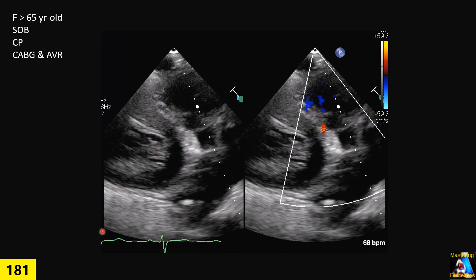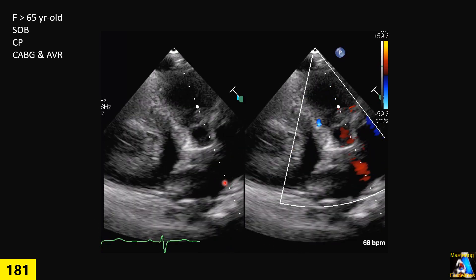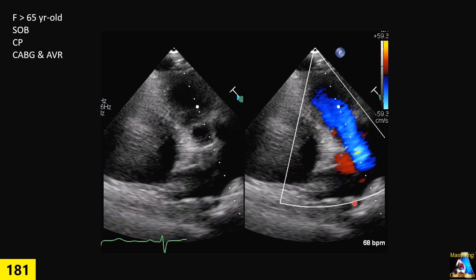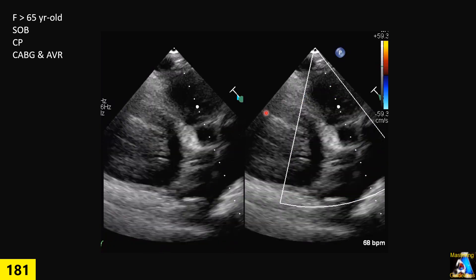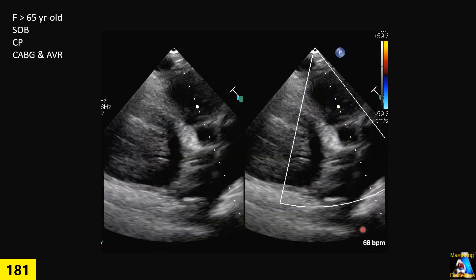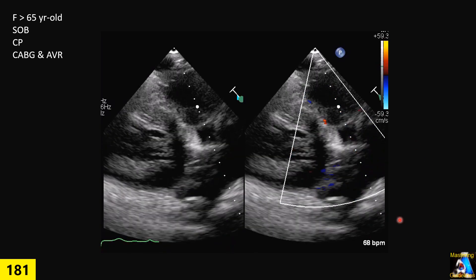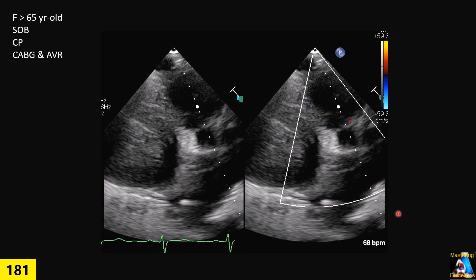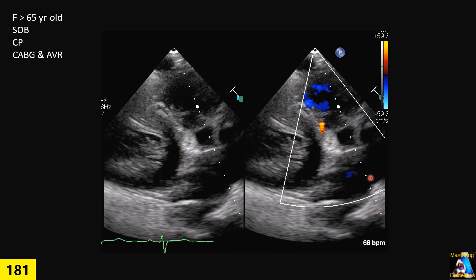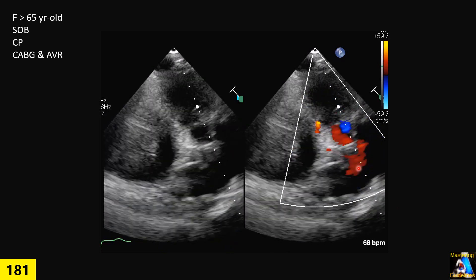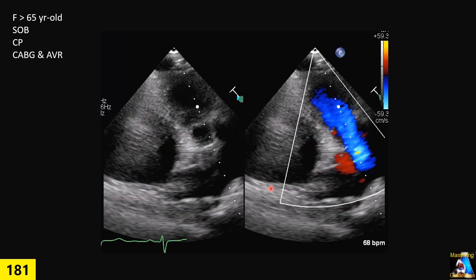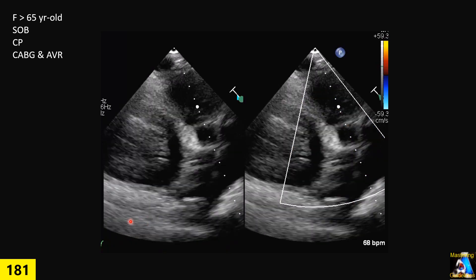In one of those views, we got this image. First of all, which view is this? Second, what abnormal finding or color Doppler finding can you see on this view?